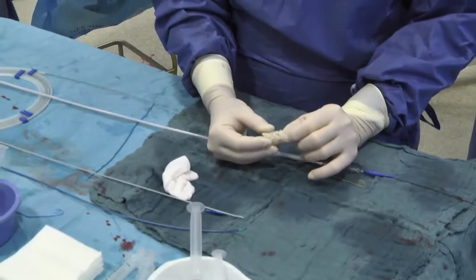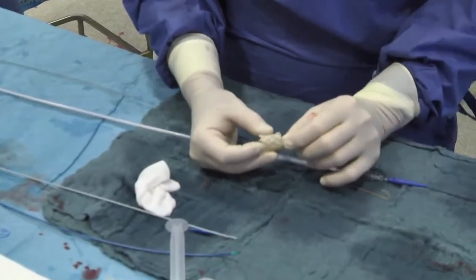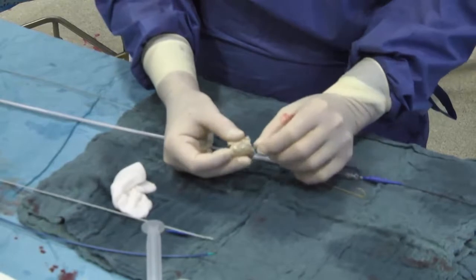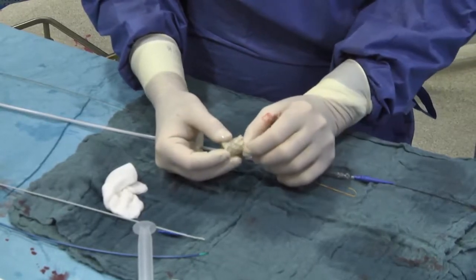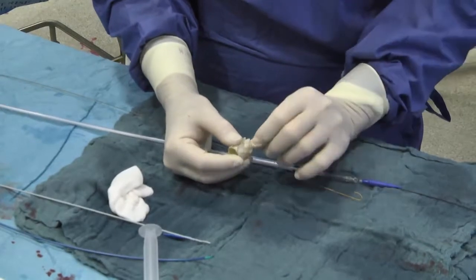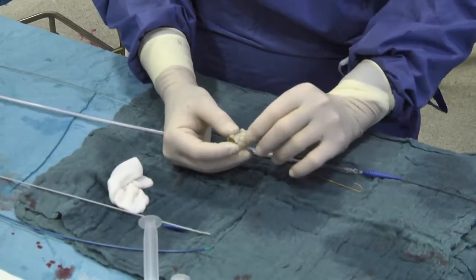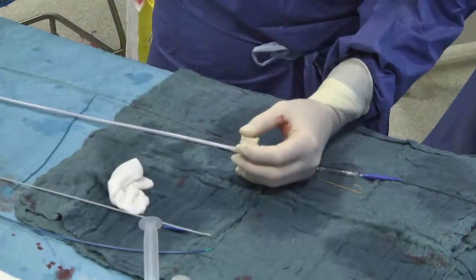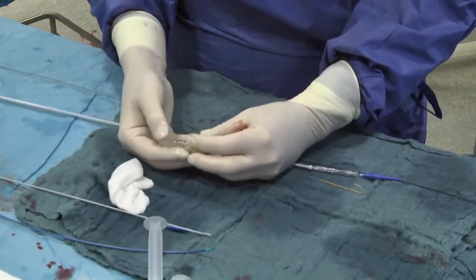There are a few things I wanted to point out in the interrogation. I think it is very important to do interrogation at low pressure, as you could see on the slides, where you could see the indentation. The angio already also showed that there was still valve tissue in the back of the outflow tract, and that is very reassuring because that will hold back any stent you put in there. Every time that you interrogate a patient with a transannular patch, if you push hard on the balloon, it will always stretch to almost gigantic measures. So the balloon occlusion with RV angiogram did show that we already, however, at 25 millimeter, had a total occlusion. So now we have standard crimping.